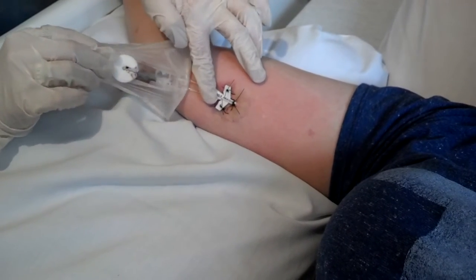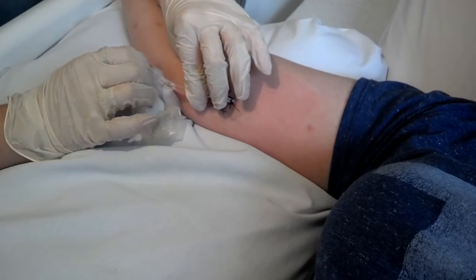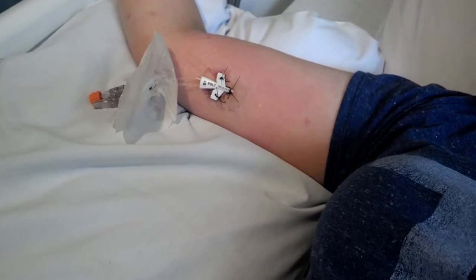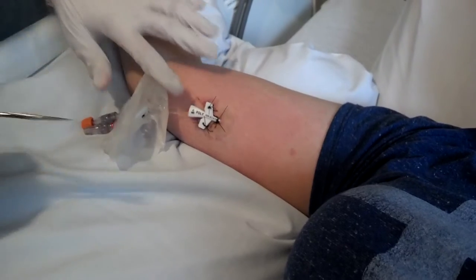So this is the removal of the PICC line. Actually, I'll just leave that there. It's going to be coming out anyway. There's some stitches in there. Yeah, just going to snip them.